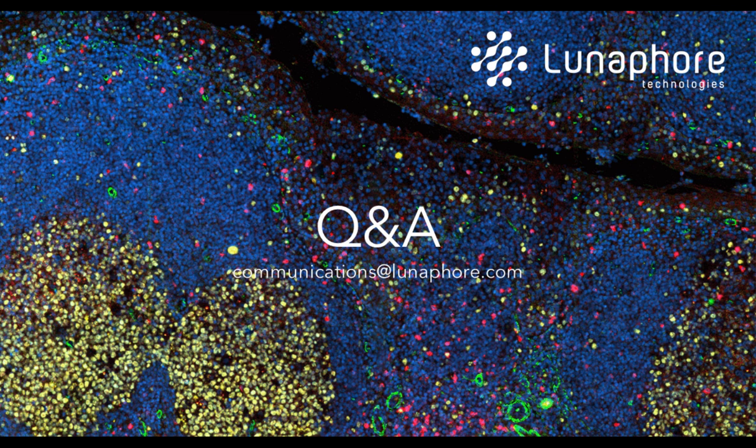Yeah, this is very interesting. I'm not sure I completely understand the question. So what we are doing is in every cycle, we get 3 images. We get one DAPI image, marker A and marker B. We take the image, then we elute, and we stain again. So we are colocalizing at the same time, let's say, 2 markers plus DAPI, but we do it over and over again, and we have our own proprietary stitching and alignment algorithm that will allow us to colocalize really all the cycles, therefore reaching the 40-plex.